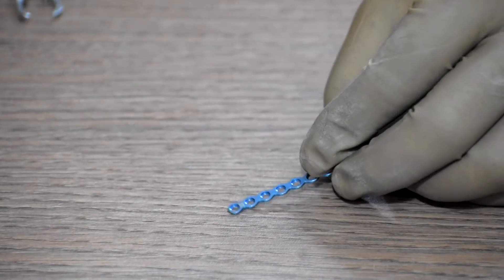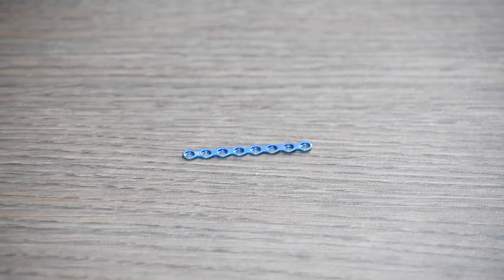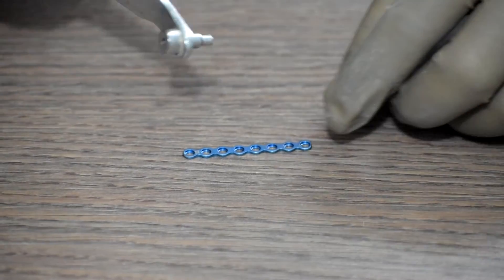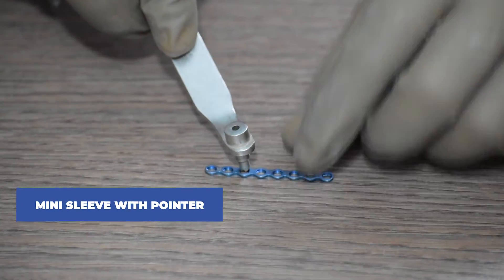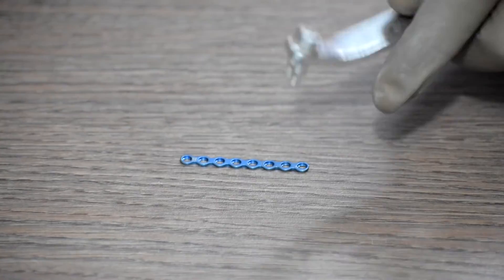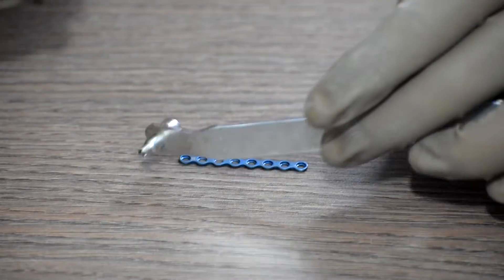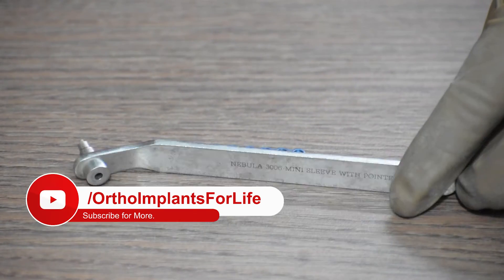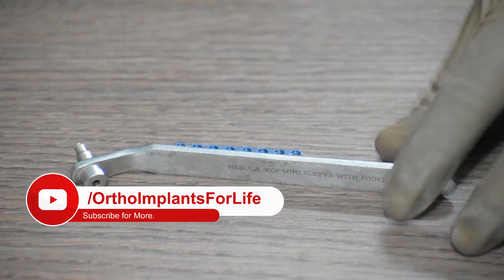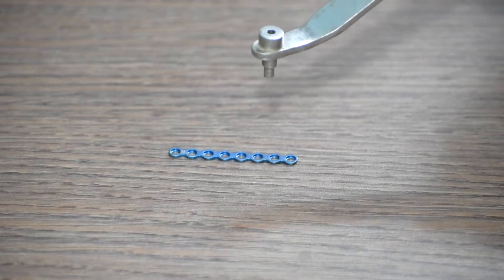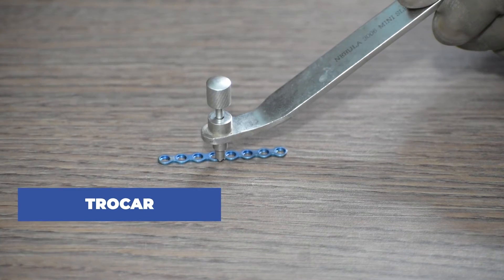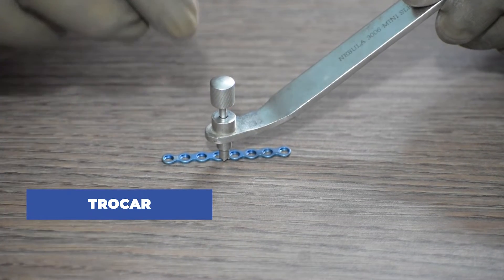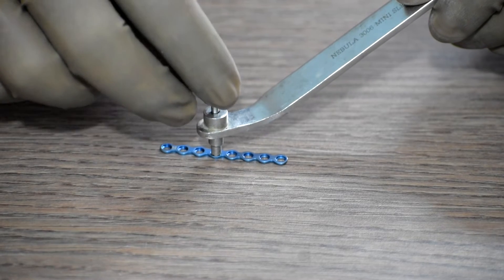Thereafter, we will have to fix the screws. For that, we will first take the mini sleeve with pointer. After we place this mini guide in the hole of the mini plate, we then use the trocar or the pointer to clean any soft tissues stuck in between.